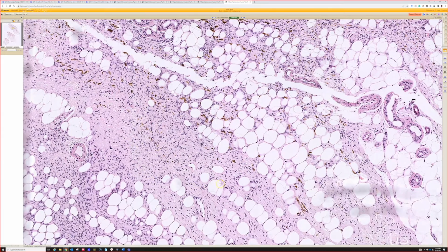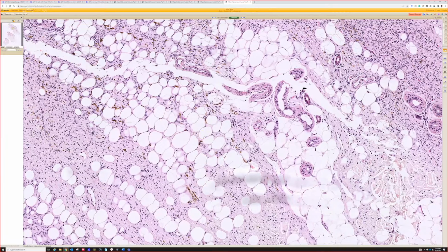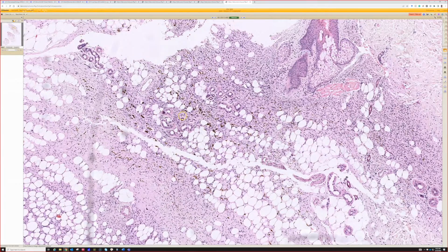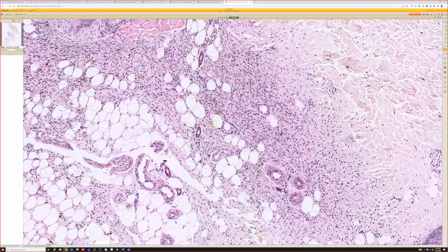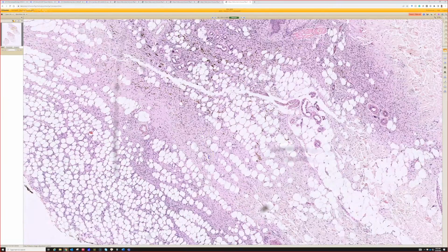Neurofibroma and DFSP can have areas that look very similar microscopically, and neurofibromas, just like DFSP, express CD34 pretty diffusely. So if you're having a doubt, do an S100 or a SOX10, which is extremely rare to have, is almost always negative in DFSP. I have seen one exception that had patchy S100, but in any case, just know that that would be one potential pitfall.